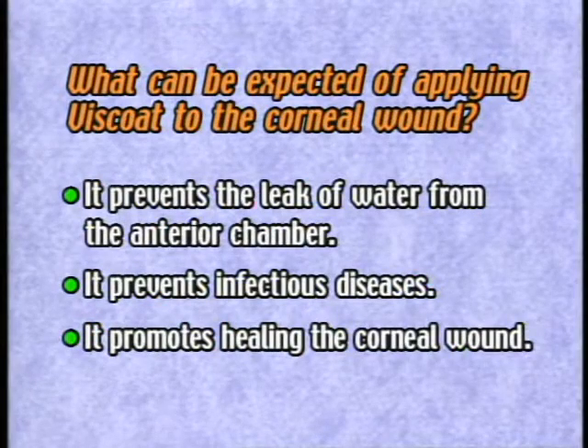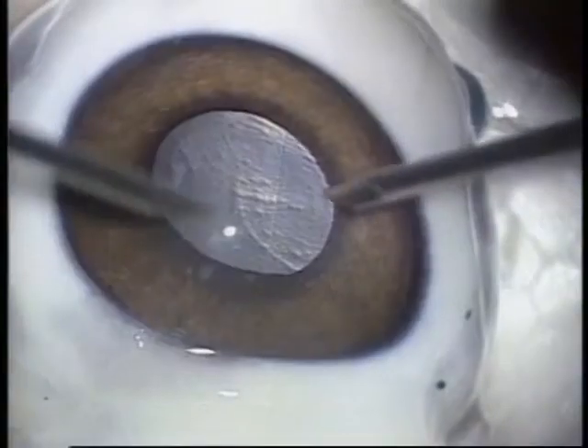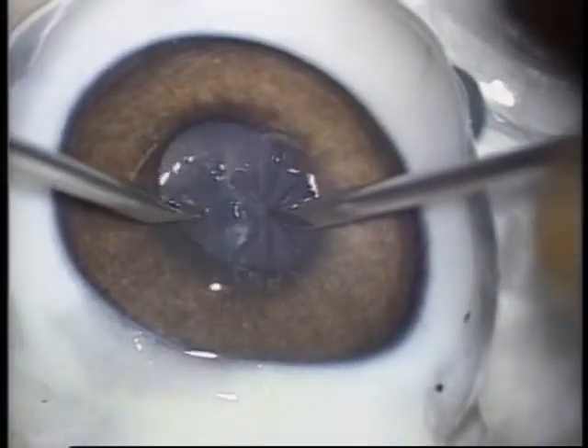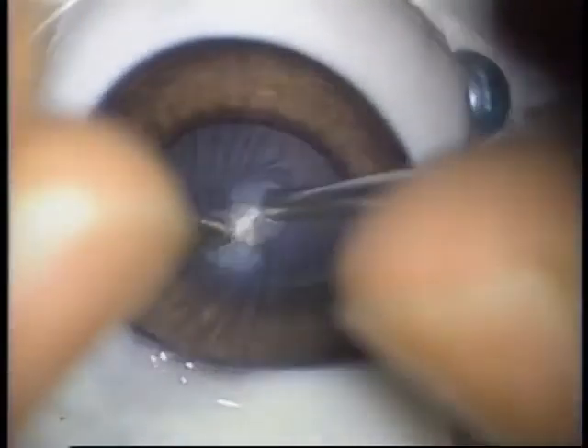Now let's look at the characteristics of viscote for self-closure of the corneal wound. In the course of performing surgery by the wet shell technique on several patients, I noticed that there was a tendency of showing better self-closure than in the case where no viscote was applied to the corneal epithelium. A pig's eye was used to examine this tendency.